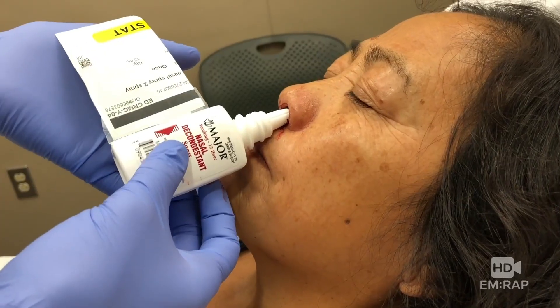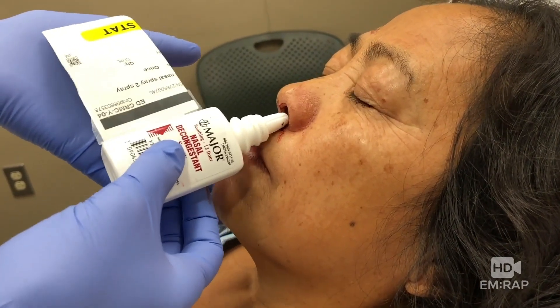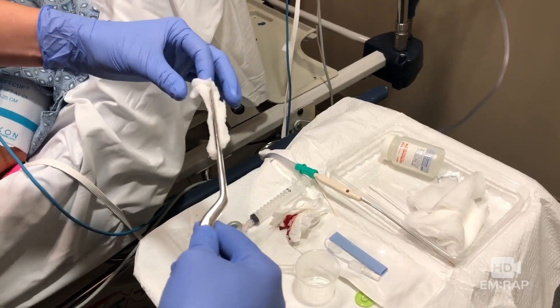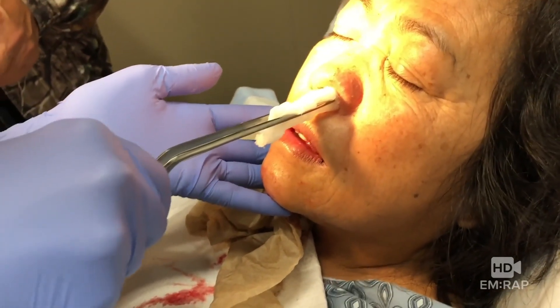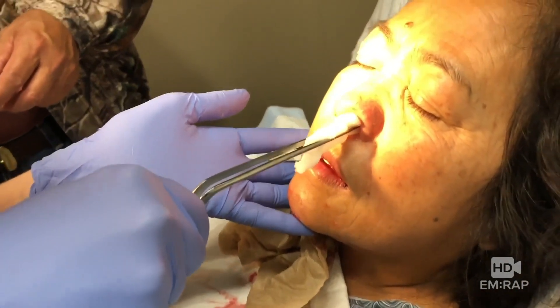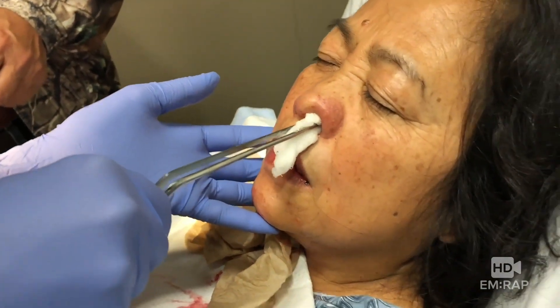She starts bleeding again — spray a little bit of oxymetazoline just to squeeze down those vessels a little bit more. Now we get ready with our TXA-soaked gauze. Using the bayonet forceps, you're going to insert this straight back, just like with any nasal pack.